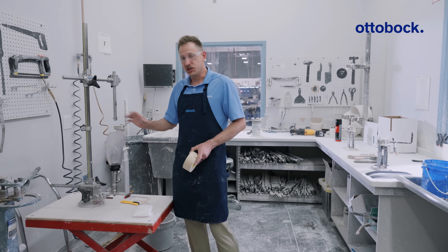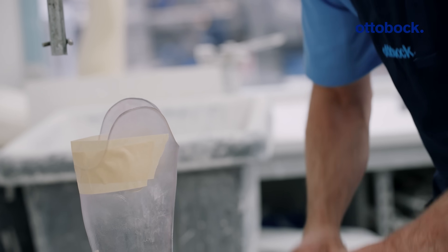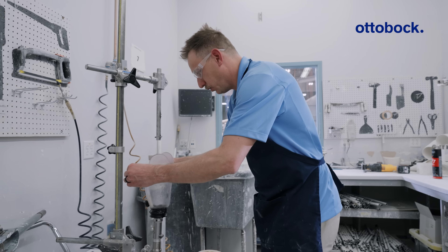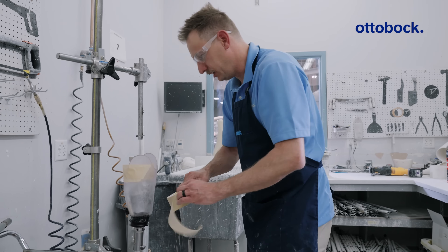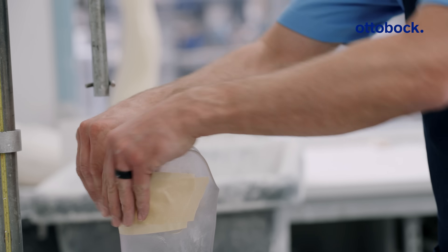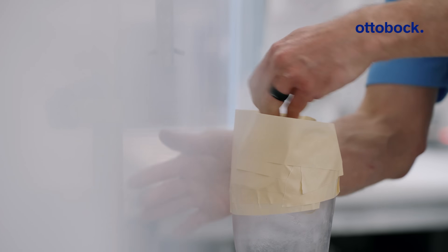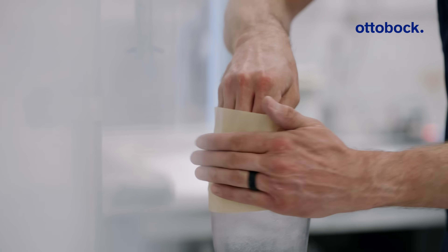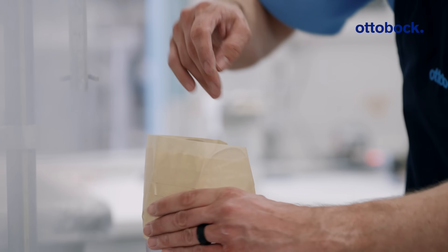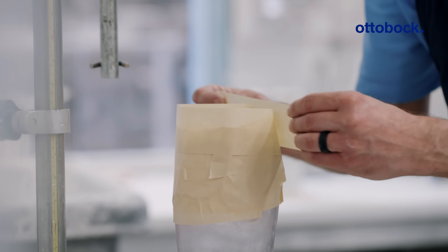We're going to start with placing in your jig and taping up the socket. I always start from the posterior and make sure that the tape is sealed really nicely around the edge of the trim line. I'll work my way up piece by piece, building up the posterior, flattening out any imperfections, then wrapping around towards the anterior and flattening around the trim line edge. I like to use the back of my hand on the inside so it doesn't stick as bad and I have good control. Be sure that you tape to at least two to three centimeters above your trim lines. Smooth it down.